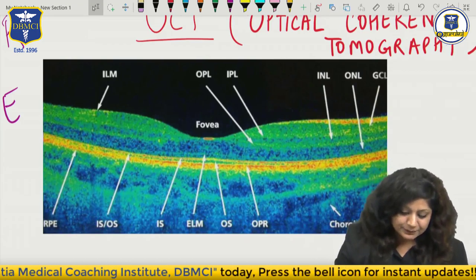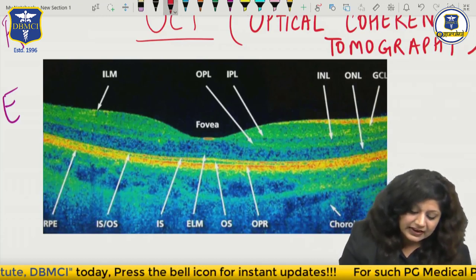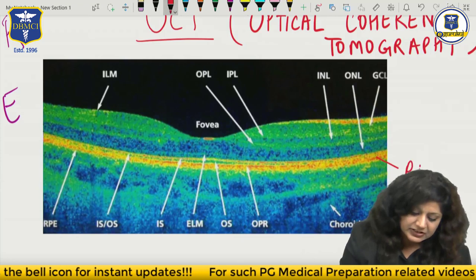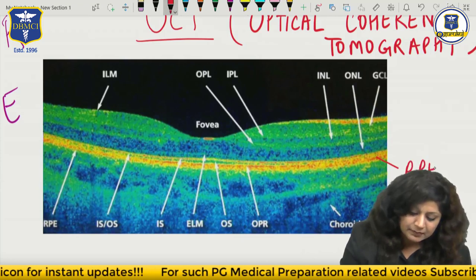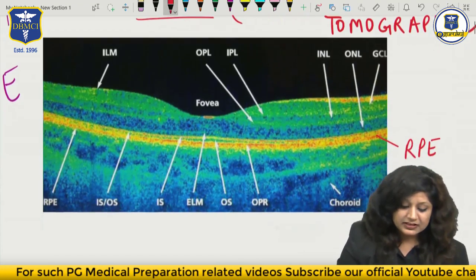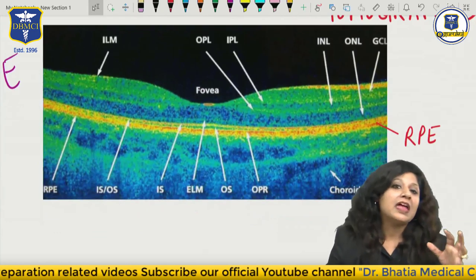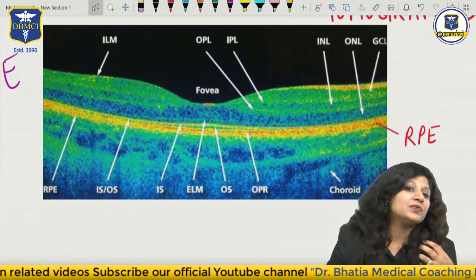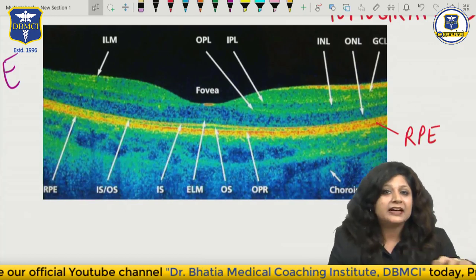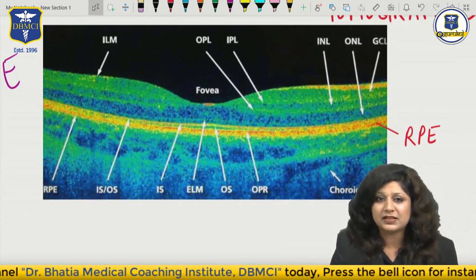Can you see here - this red layer that you can see is the outermost layer, that is the retinal pigment epithelium. Now as I say, this is actually the pigment epithelium, therefore it is reddish in colour. You will see a red bright layer - that is the pigment epithelium.